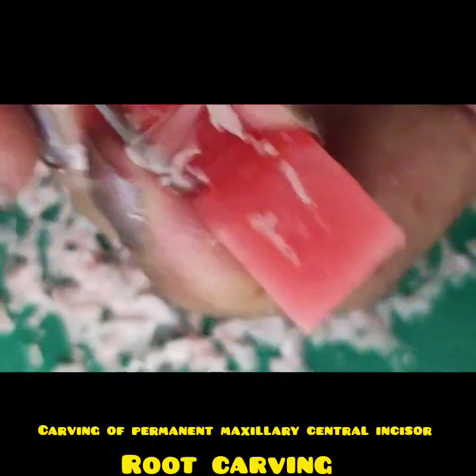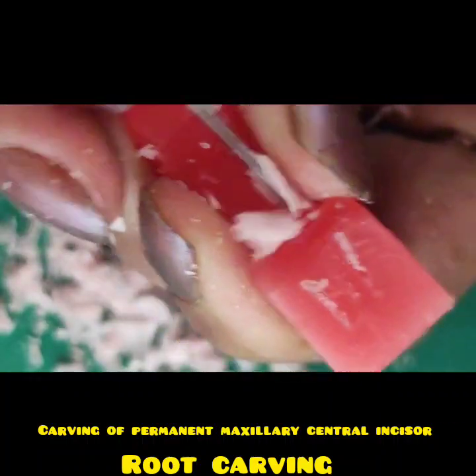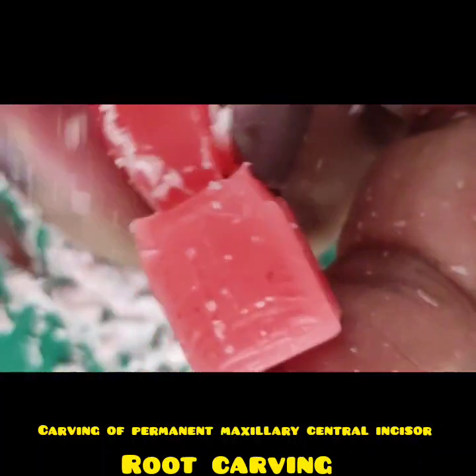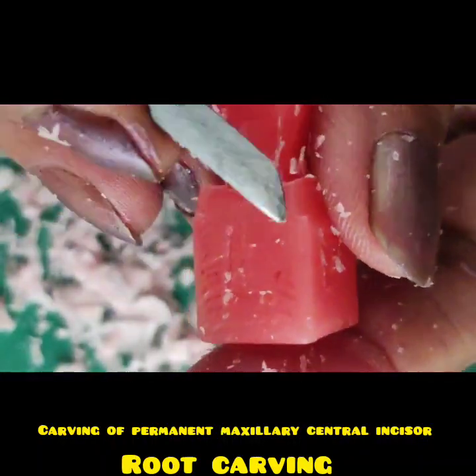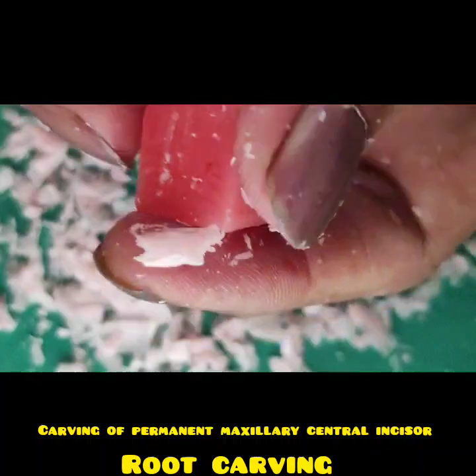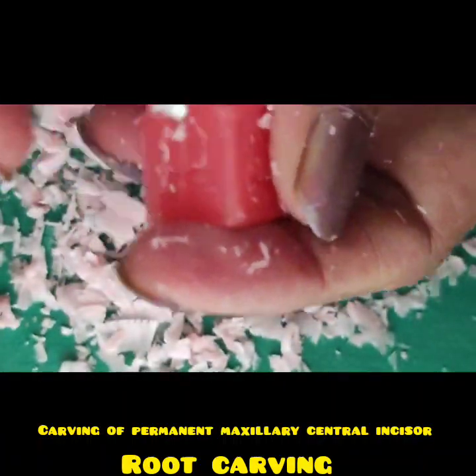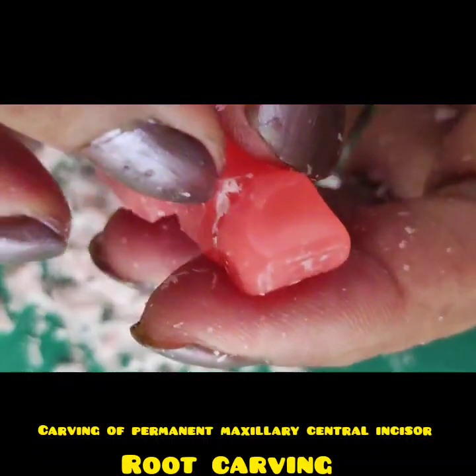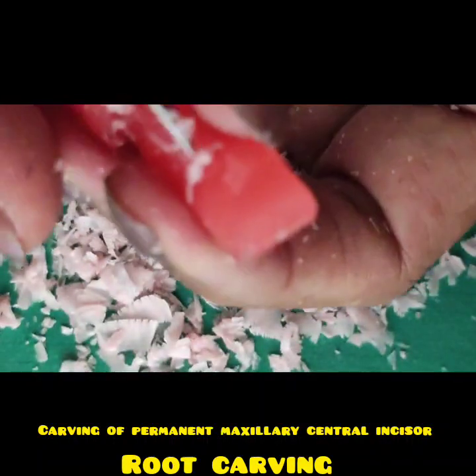Now the last side, so from all four sides. On all four sides you need to reduce. Now still there is this step, an extra layer of wax.